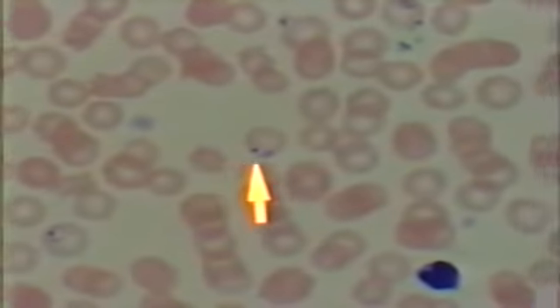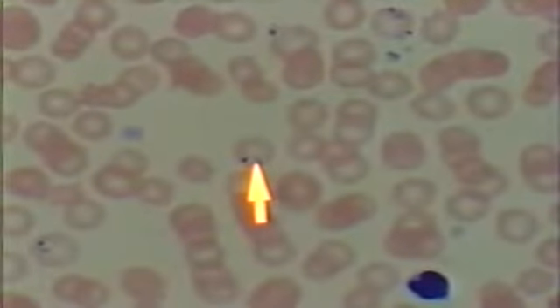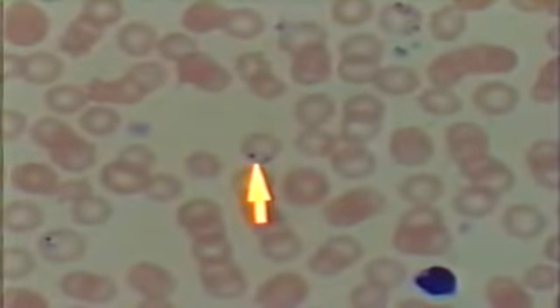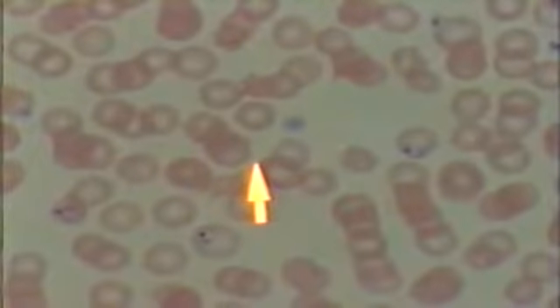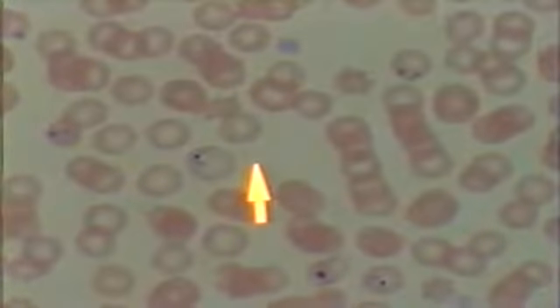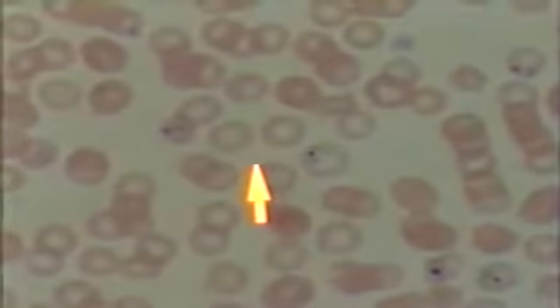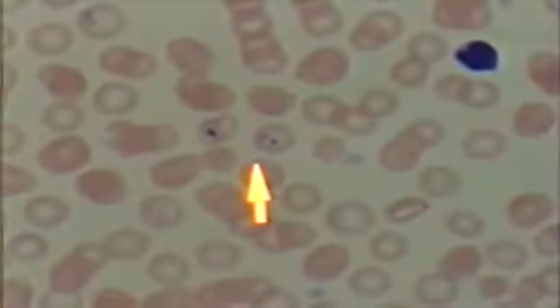and then the red blood cells. In and amongst the red blood cells you should see various developmental stages, and in the case of vivax you should be able to find the various developmental stages, everything from the signet ring trophozoite stage to the schizont stages, and you may even find some gametocyte developmental stages. With the video system, it's difficult to get an effective enough resolution to show you very well the developmental stages other than the ring stages.